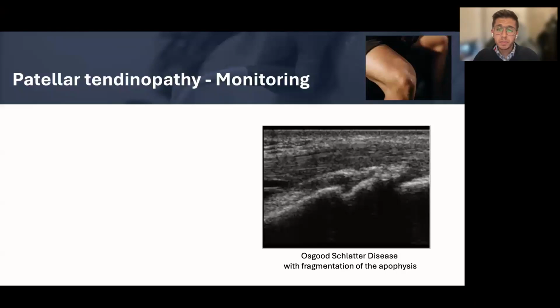Finally, coming to the patella tendon, again, a really nice superficial tendon you can really buy in patients with in terms of the diagnosis. And you can range this from young patients with Osgood-Schlatter's disease all the way up to your more chronic middle-aged patella tendinopathies, because the ultrasound findings are so helpful and clear.